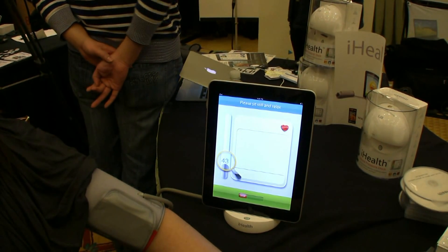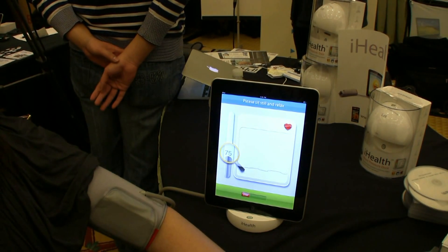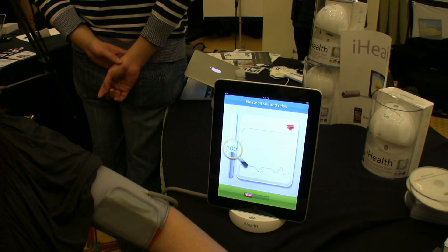She's sitting still, and right now it's pumping pressure to her arm, and we're starting to get a reading on her heartbeat, and it looks very healthy.